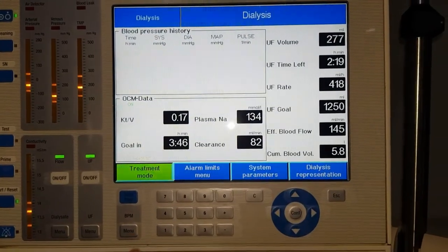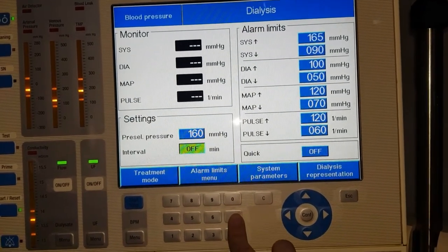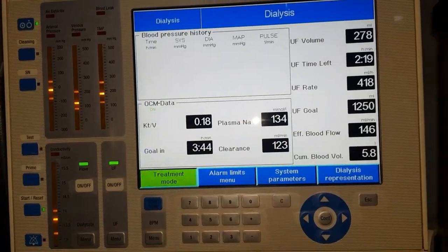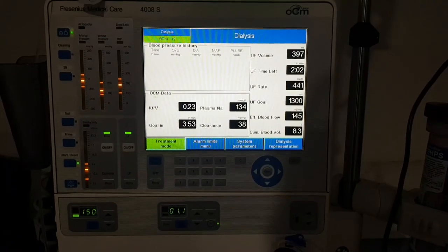Now that we know how to flush the exact volume, let's get the machine to alarm every 15 minutes. How I do it: use the automatic blood pressure feature. Set it for 15 minutes and just leave it — it will definitely alarm since there will be no blood pressure taken.